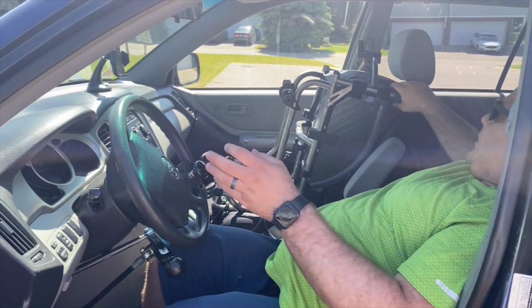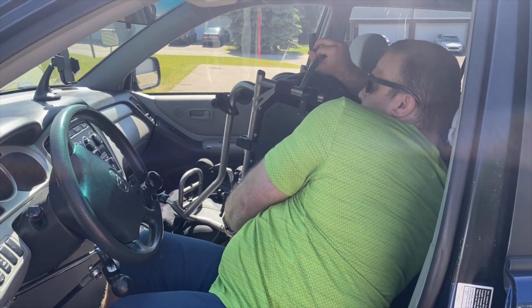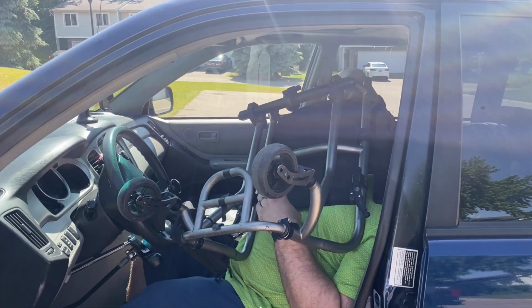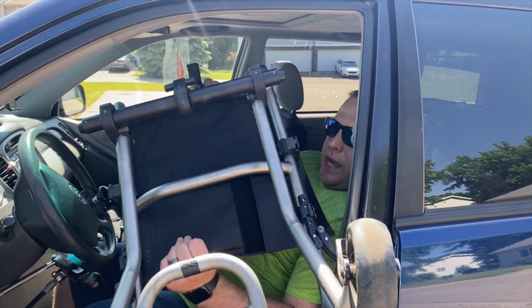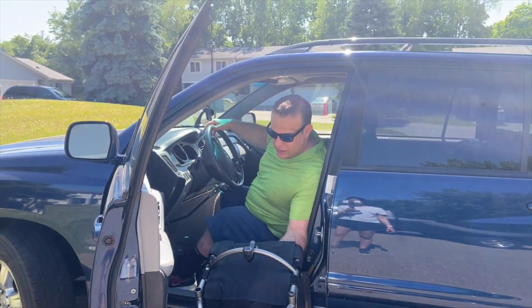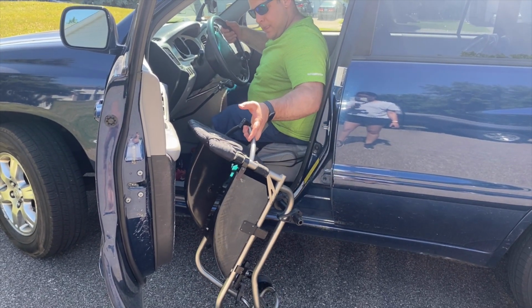The same thing here. I'll get the chair kind of unstuck, so to speak, but the weight again, I try to keep as much in that left hand as possible. And when I get to here, I kind of rest it against my chest and then adjust my hand so that I can set it down. My first set is not against the door, but there, and then I can rotate and get on the back side of it, and then do that.